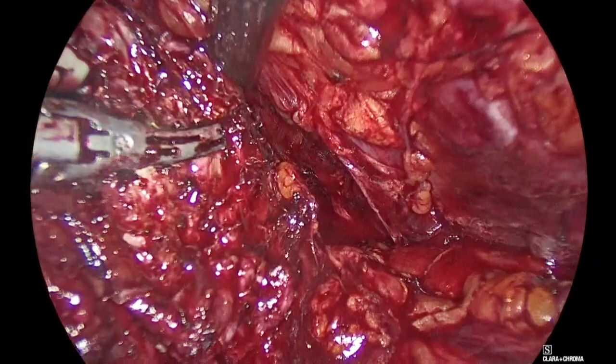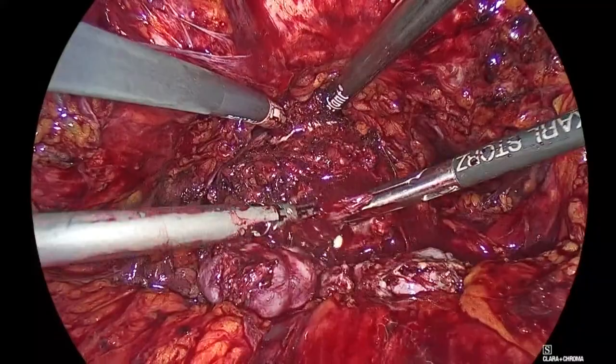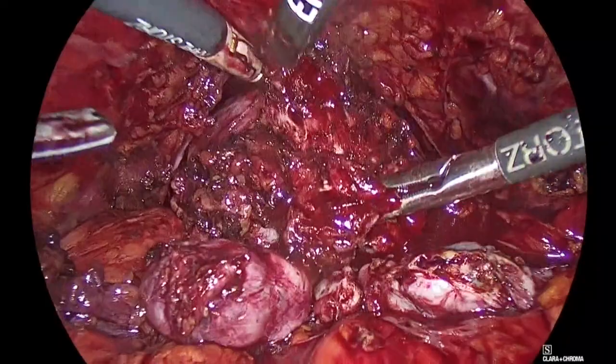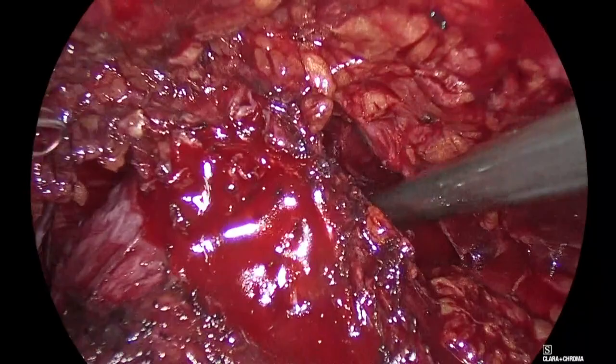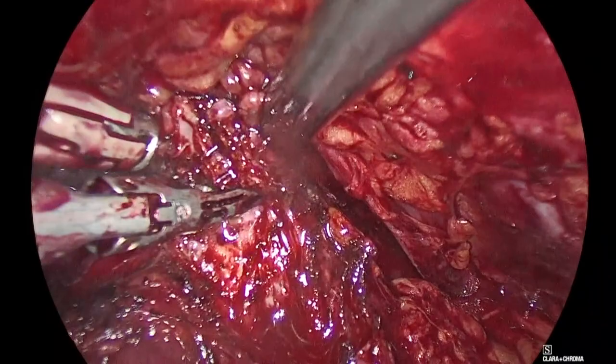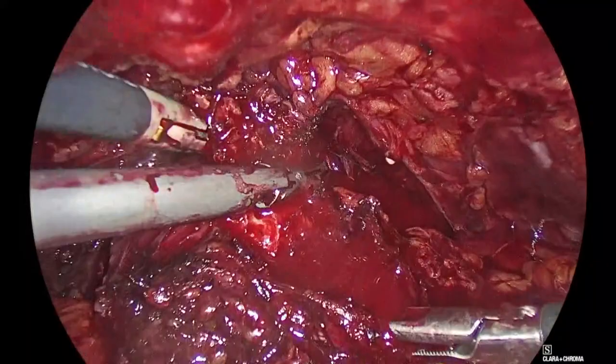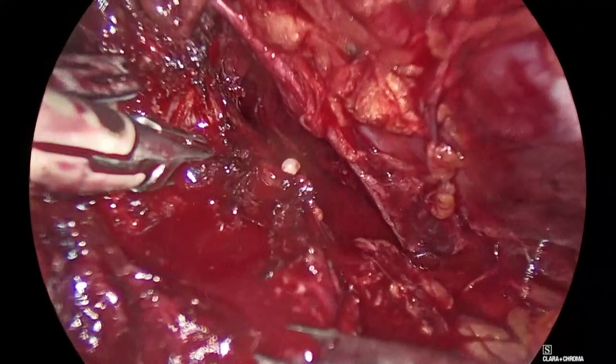Length, Panayuti. Let me see how he's pulling. Show me, Panayotis. Grasp it nice. Grasp it better. Grasp it stronger. There. Correct. Pull down. Good. You see that this is occluding. You see this? There. Good. Don't aspirate. Give me length, Panayuti. Good. Panagiotis, the other side. Put your grasp here, your suction here. There. Good. Come on the right side, Padeli, please. Right side for me. Good. Panagiotis, do not aspirate.